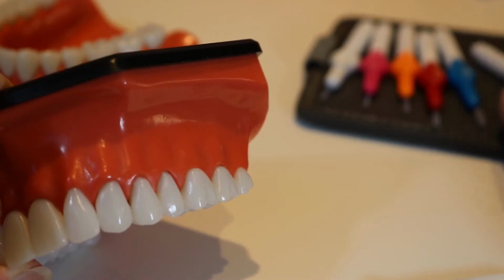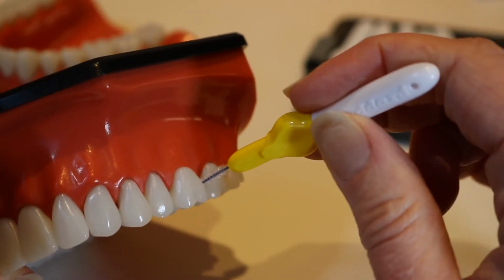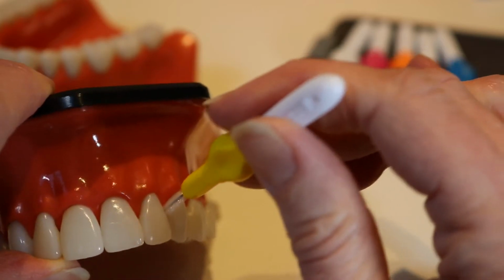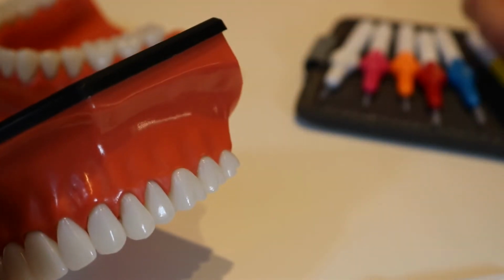So we're going to move on to the next colour, which is the yellow, and see whether this one goes in any of the gaps. Well, we know it's going to go in there because the bigger one, the green one, goes in there. But that's all for this one. So let's move to the blue.